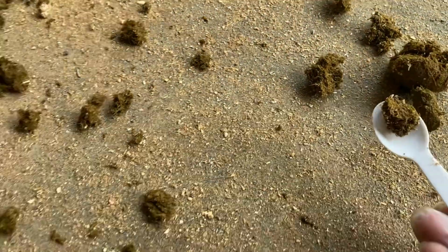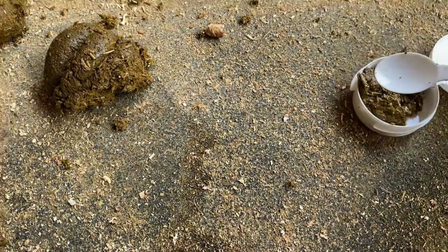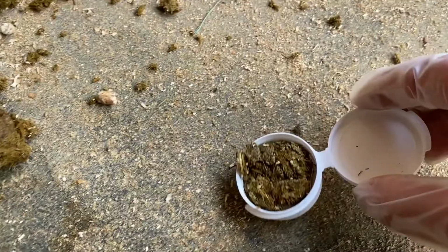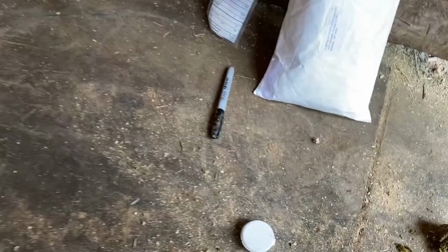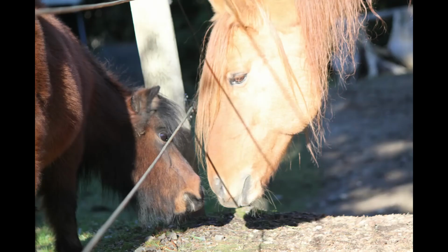A positive test indicates that worms are present. Generally, if the lab finds more than 2 or 3 eggs per slide, they suggest deworming. By identifying intestinal parasites and knowing the fecal egg count, we can devise a customized deworming program specific to our sanctuary animals. This allows us to use the least amount of chemicals possible to keep our animals healthy.